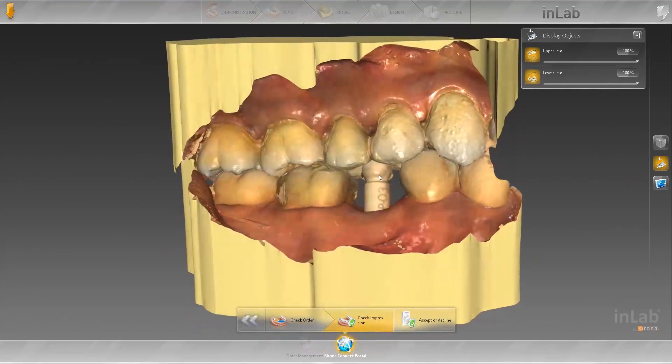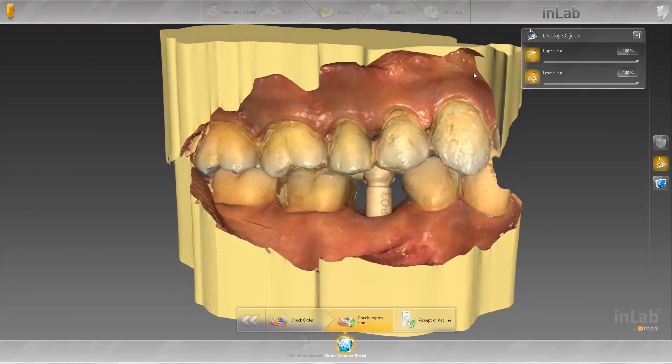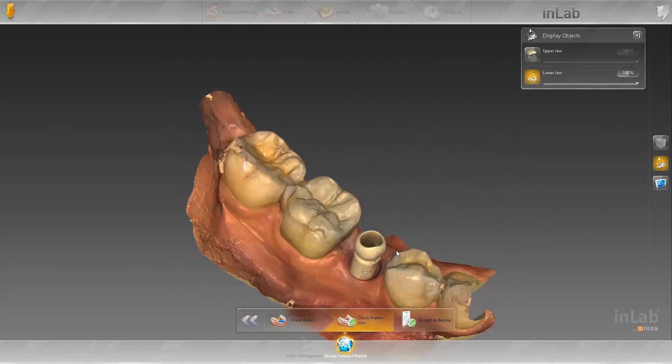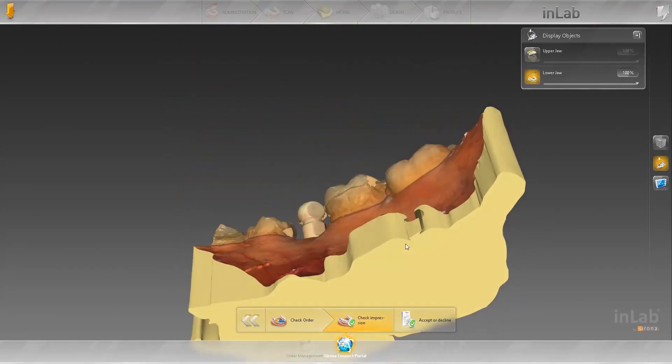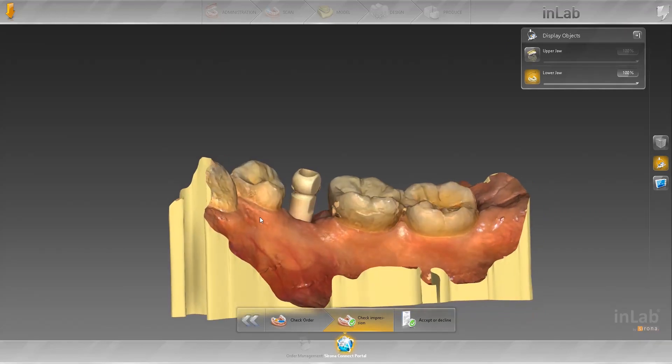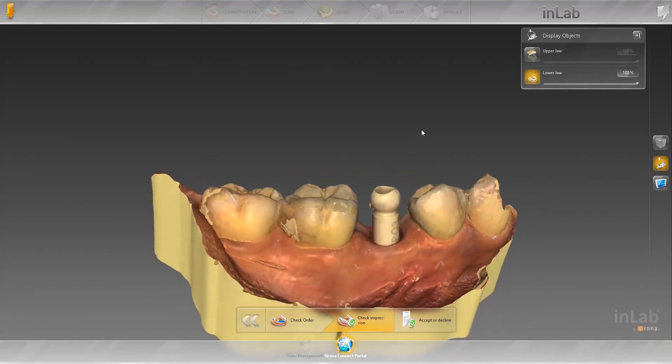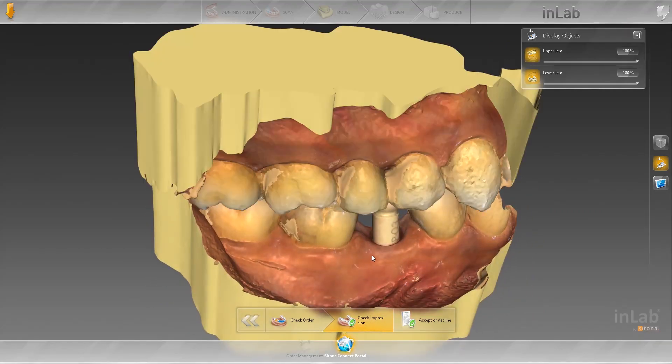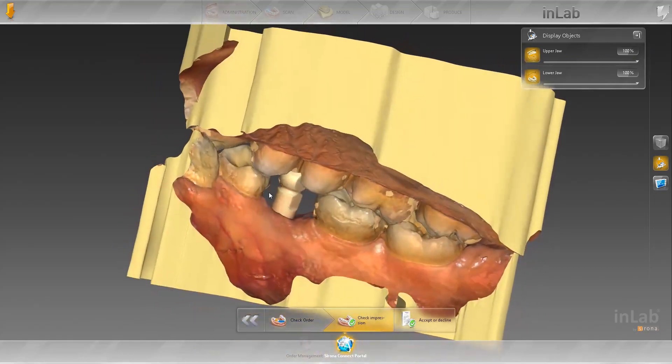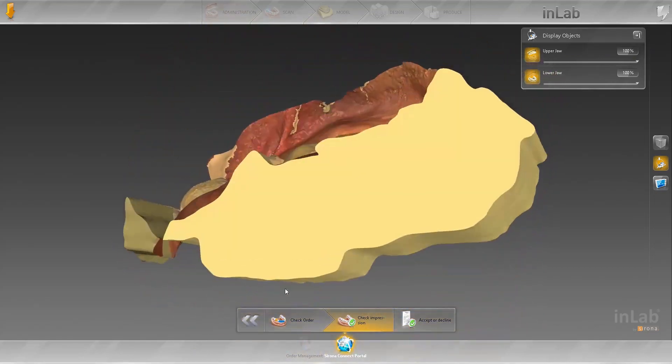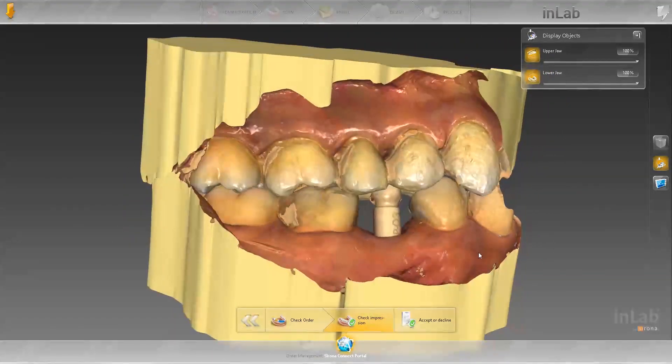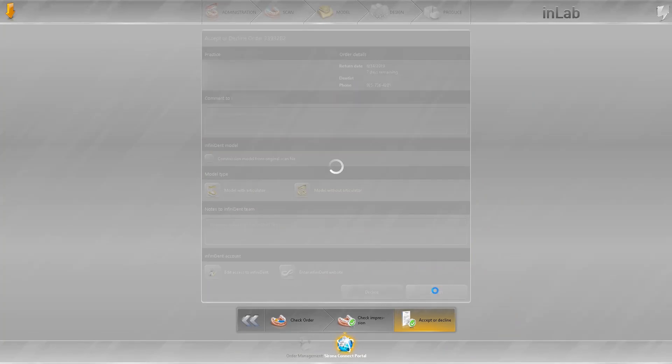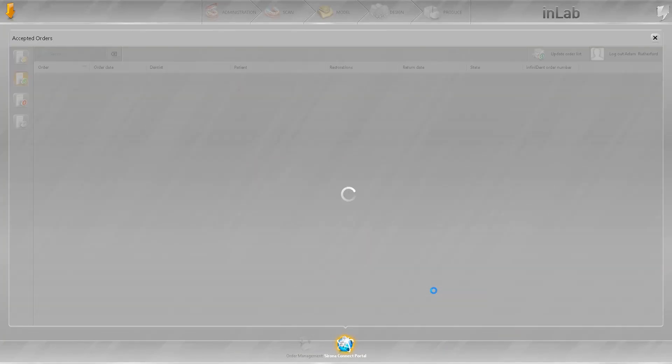Okay, here we go. This is an Atlantis scan body. You can see here, probably an Astra EB case. Check to make sure everything looks good. Bite looks pretty good so we can go ahead and accept this case.